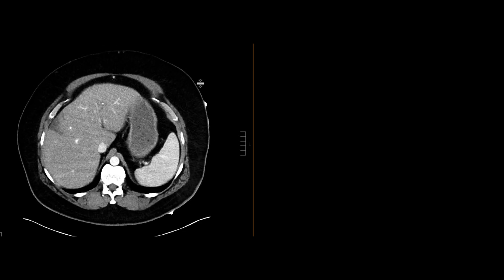I want you to focus right here on the liver. As we scroll through this, we can see that there is some sort of abnormality within the liver. It sort of spans the right hepatic lobe, goes into the left hepatic lobe, segment four area, and it really does look rather geographic — sort of straight lines, wedge-shaped. It's low in attenuation, but on this study it was felt to be indeterminate.